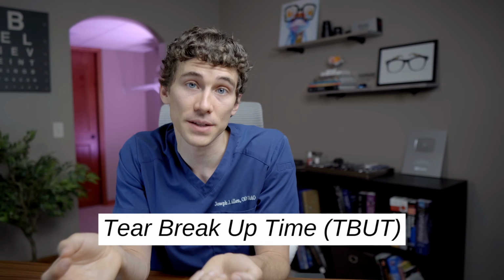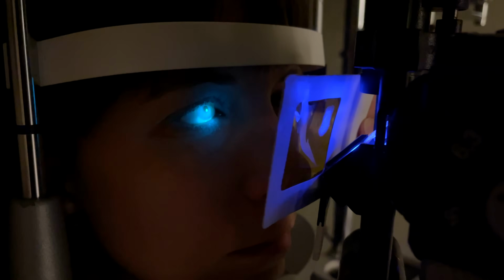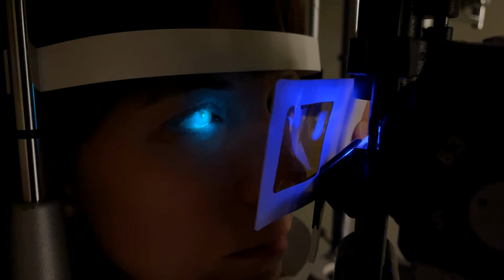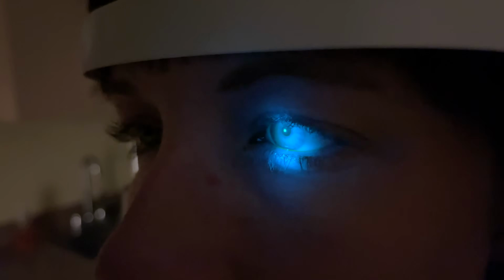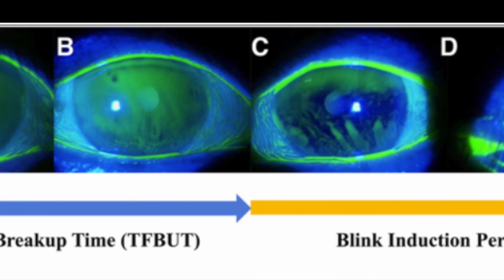Okay, another thing that we use that fluorescein staining for is also measuring for what is called T-BUT, or tear breakup time, which is really done easily. Your doctor's just looking at the eye, asking you to close your eyes and then open them up and hold them open while they're observing for how the tear film on the front surface of the eye separates and breaks up. And while that's occurring, your doctor is counting back in their head from 0, 1, 2, 3, and then once the tear film has broken up, then they know your tear breakup time.